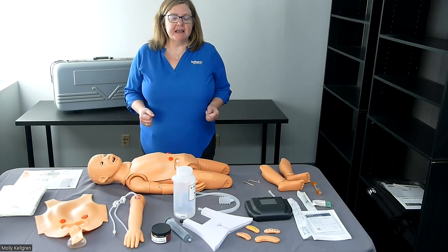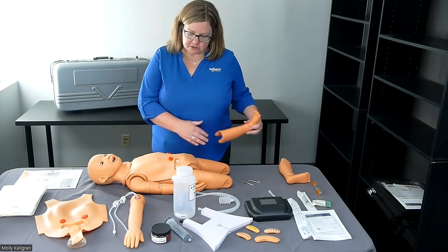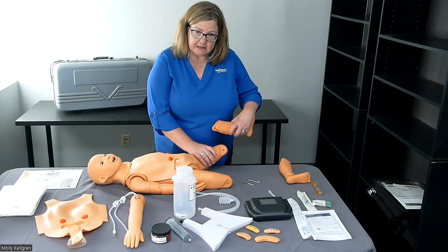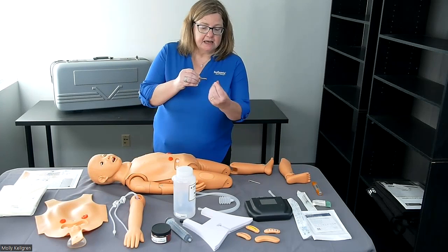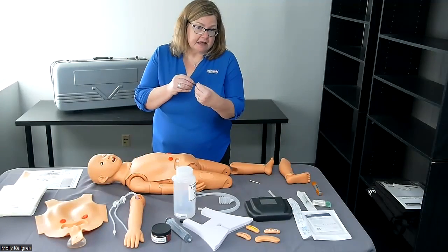Now that we've unboxed the pediatric nursing mannequin, let's go ahead and take the first step, which is to attach the lower leg to the rest of the torso. We'll do that by sliding the leg over the stump and lining up the holes that are located on both parts. Once we line up the holes, we'll insert the connector pin and then fit the screw on the other end and tighten using a flathead screwdriver.